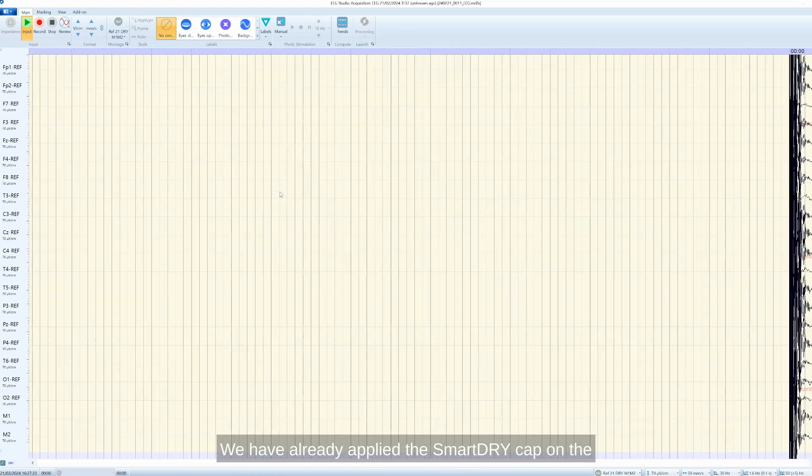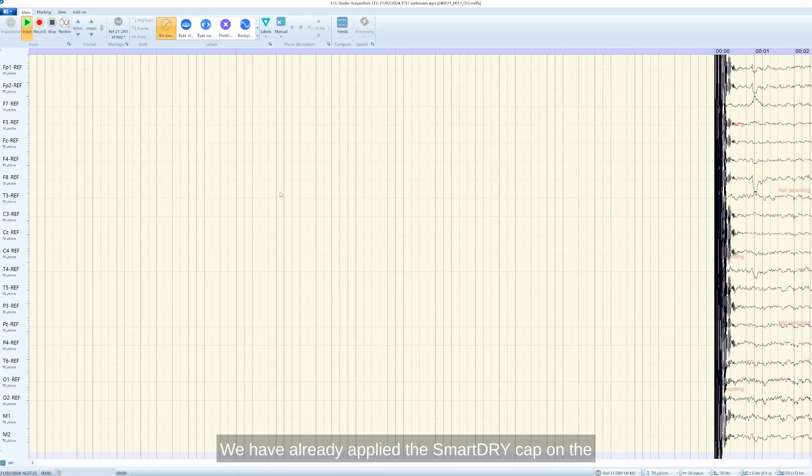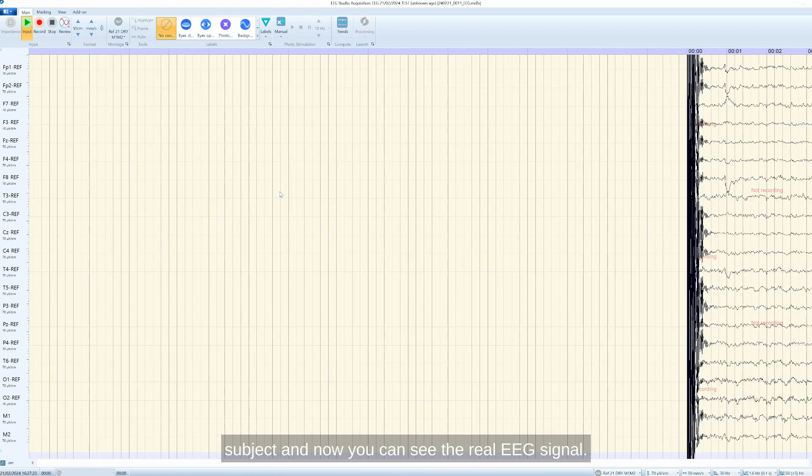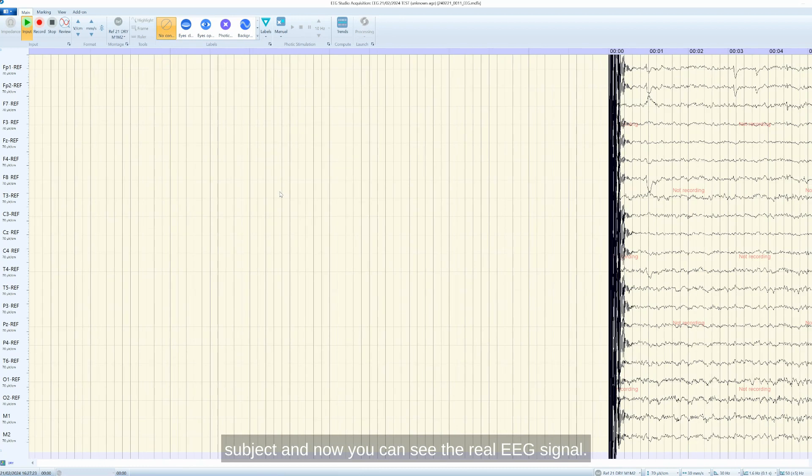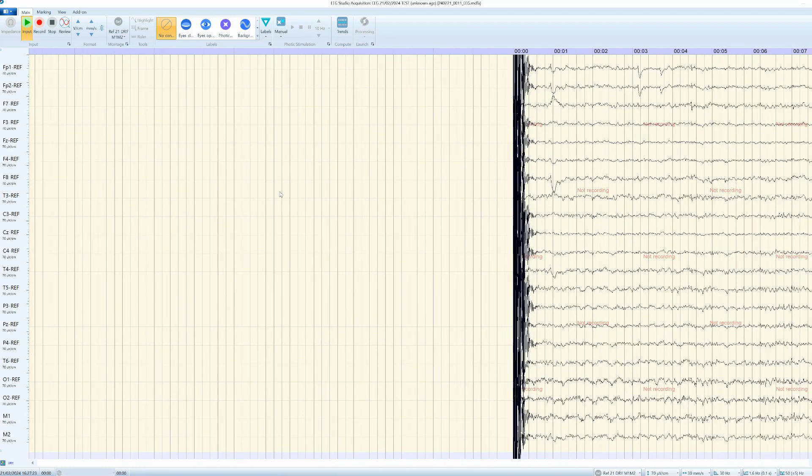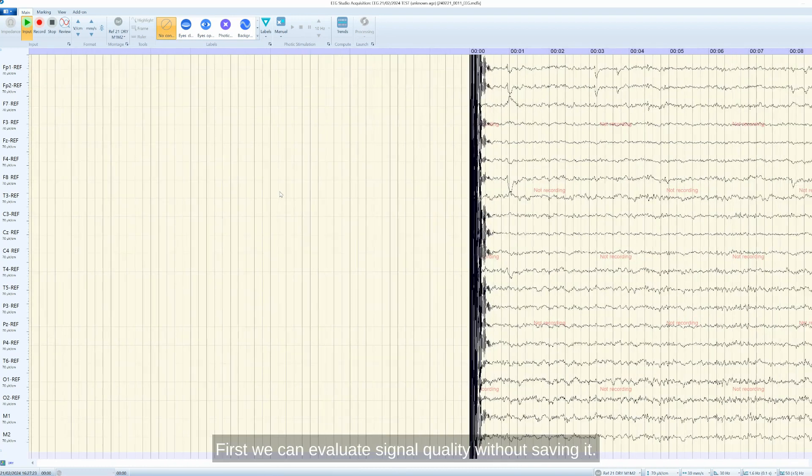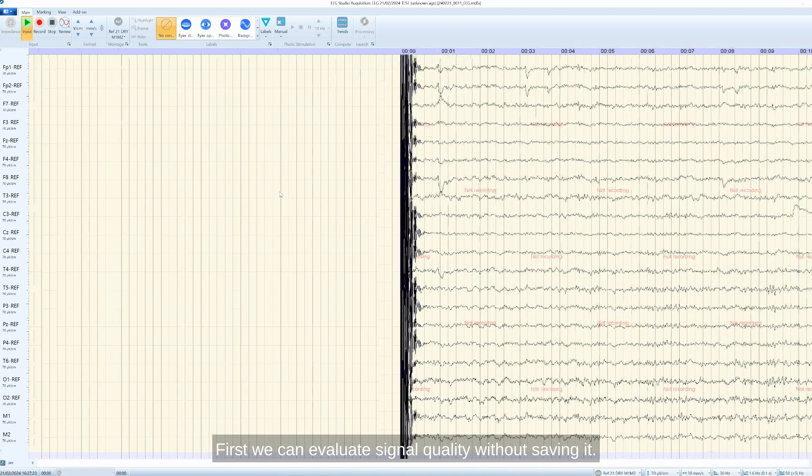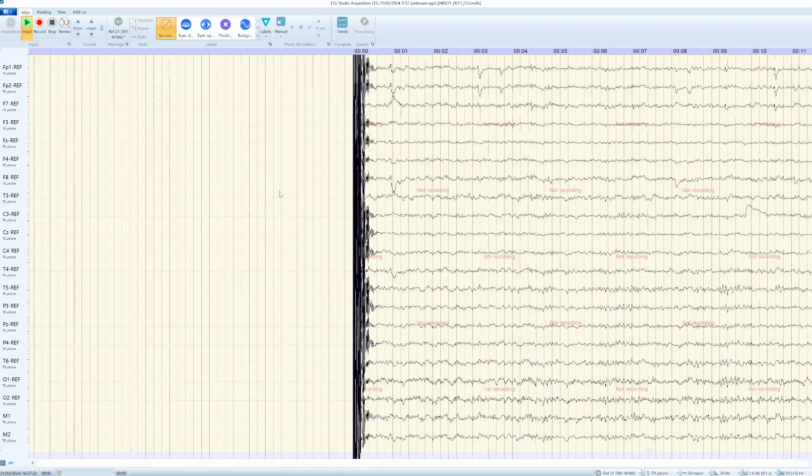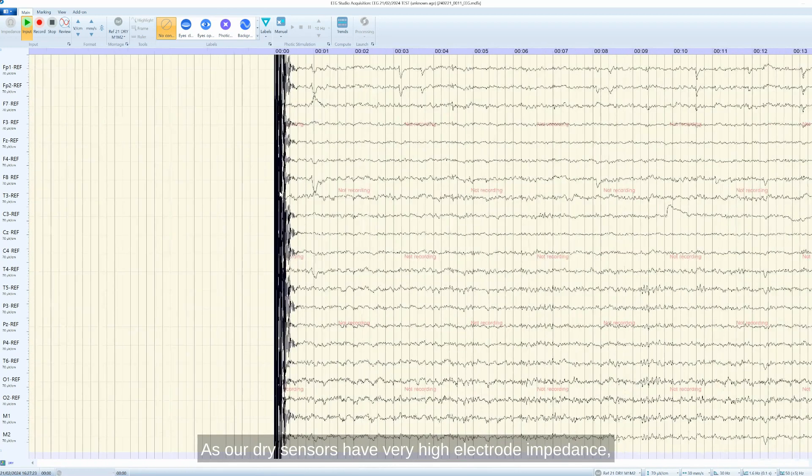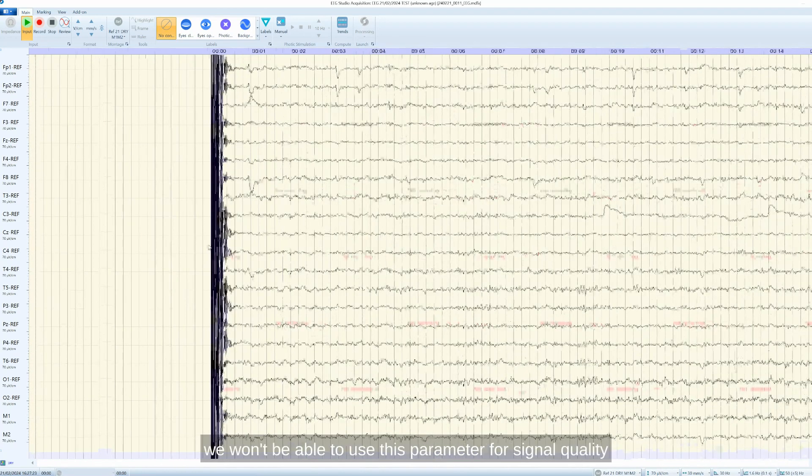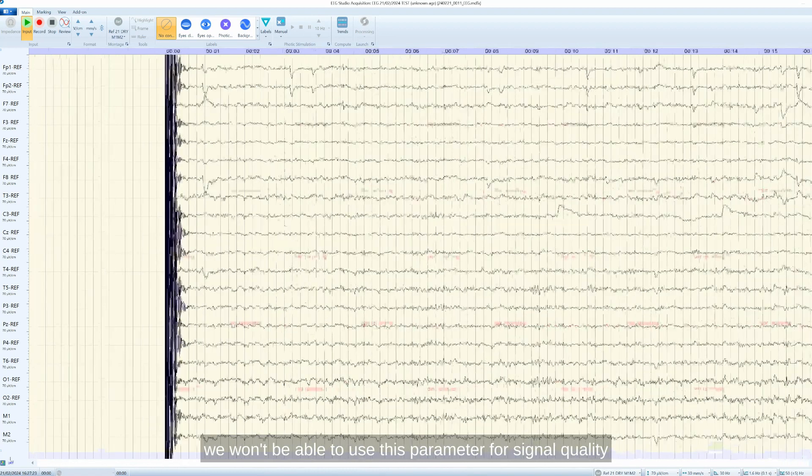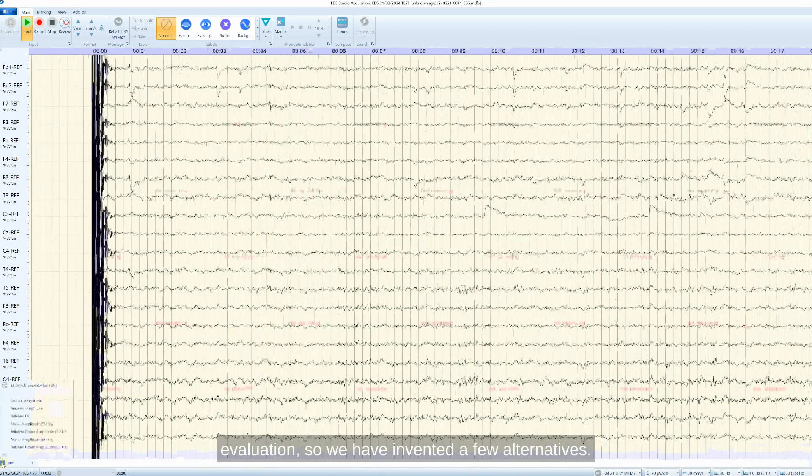We have already applied the smart dry cap on the subject and now you can see the real EEG signal here. First, we can evaluate signal quality without saving it. As our dry sensors have very high electrode impedance, we won't be able to use this parameter for signal quality evaluation.